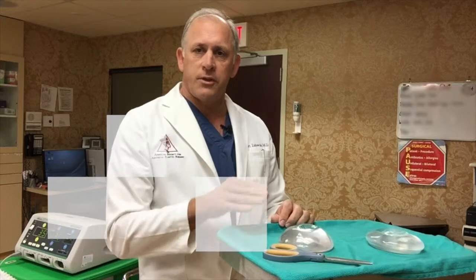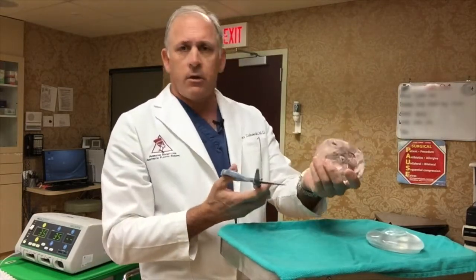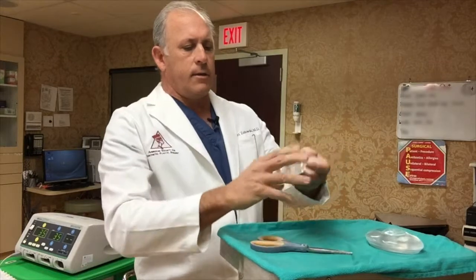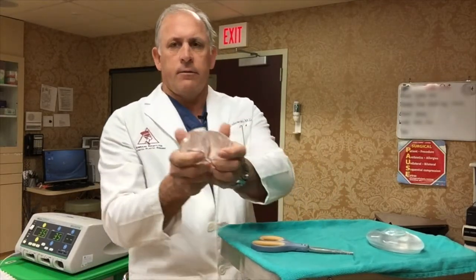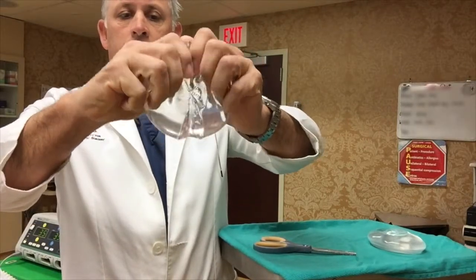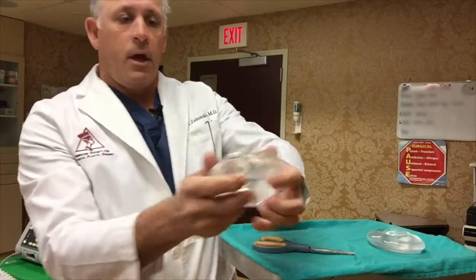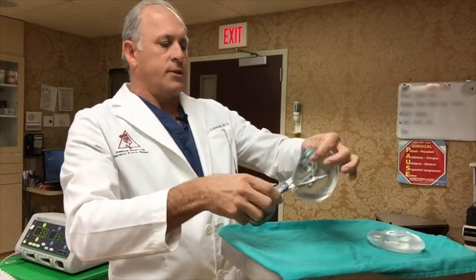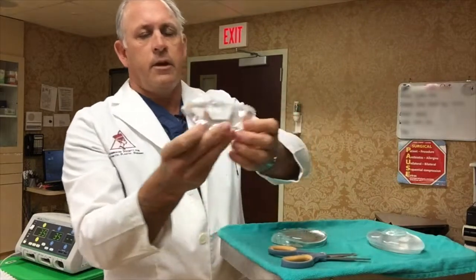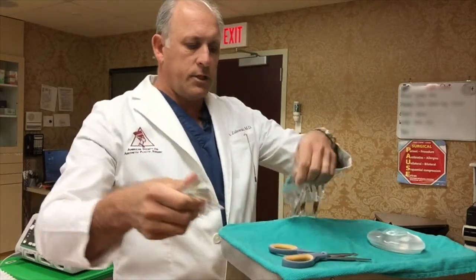I just want to show you the differences between the silicone and the saline implants in the event of a rupture. We talked about the silicone implants being cohesive gel. This is a silicone implant. If I cut that implant right in half with scissors, the gel will be very tacky and bulge and retract just like that, you can see. But it maintains its shape. The silicone doesn't run out. And it stays together, therefore cohesive gel. I can cut this further, right in half, and it will have the same effect. There's that implant cut right in half, and you can see the gel just bulges and retracts, but maintains its shape. And here's the other half.